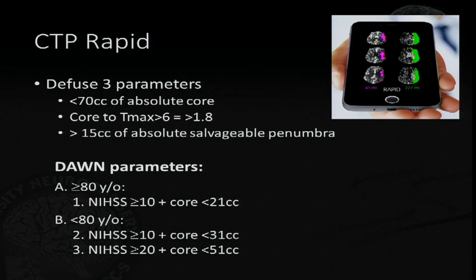The threshold of the ischemic core for cerebral blood flow is 30%. So less than 30% blood flow is the ischemic core. Okay? A threshold of 38% is going to predict the volume very well compared to DWI, but it overcalls a little bit. So 30% will not overcall. That means that that particular tissue of brain has less than 30% of normal blood flow. Okay?